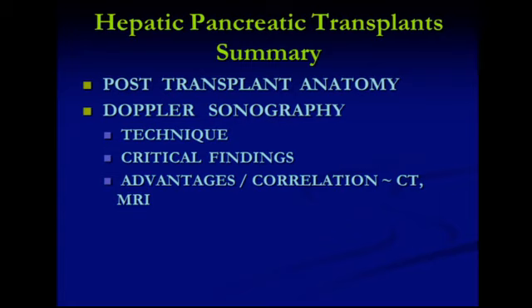So with that, that's a relatively brief summary of the role of ultrasound in the imaging of patients with hepatic and pancreatic transplants. Thank you.